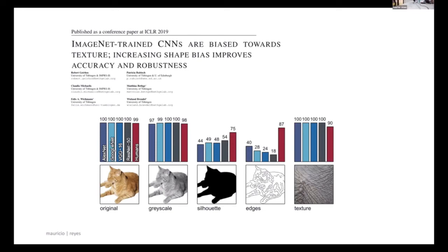And these types of examples are called ablation studies. What we have here is we remove part of the information and we evaluate how the system reacts. This type of interpretability approach is more or less the basic one, the first ones that have been used for many years. Removal of information can also show you how that perturbation affects performance. And by a reduction of performance, you can see the importance of the information that's being removed.